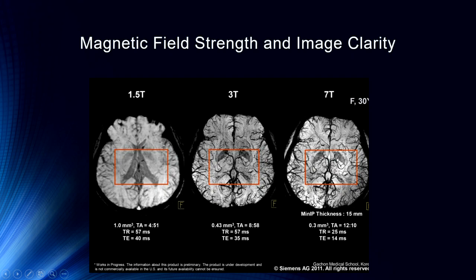And some people can't get MRIs because they might have metal in them. So for example, if somebody is a welder, oftentimes they won't allow them, or any other metal worker, I should say, to have an MRI because that metal can get there. Most of those people have some levels of metal embedded in them somewhere, just from that overall practice, even from things like inhaling metal fragments. And so those metal fragments will get ripped out, and that's not something we want to do.